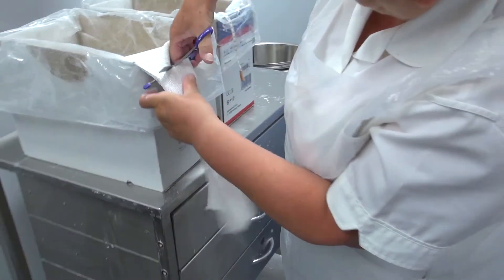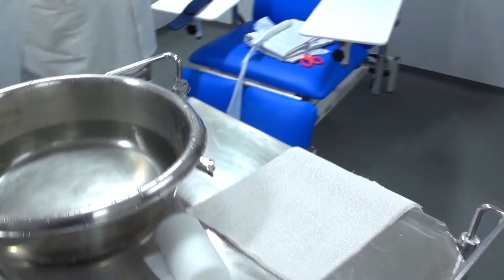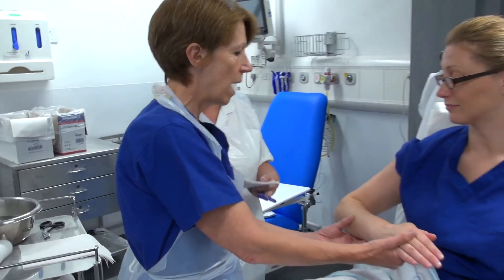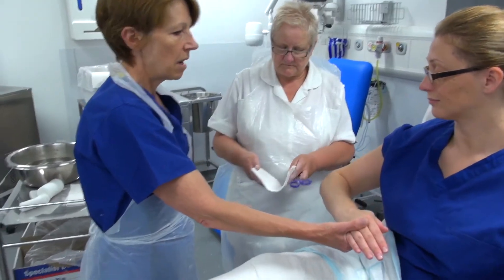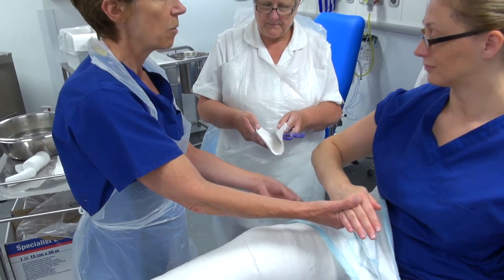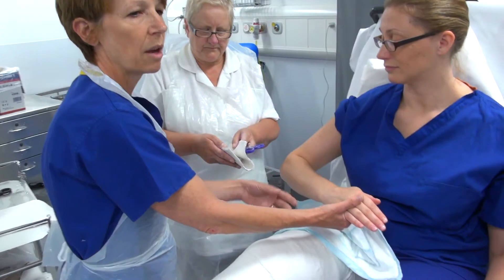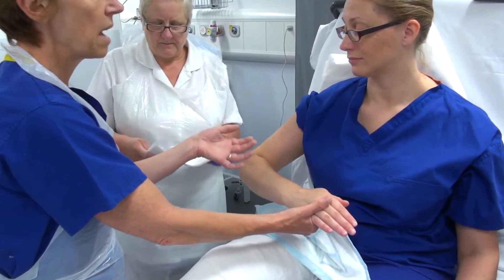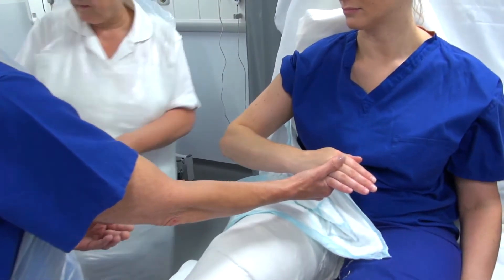Pam is just preparing the back slab, which is a 20 centimetre bandage and it is five layers thick. She's also taken a wedge of plaster which is going to be used as a slab on the bottom of the cast. This allows the weight to develop, which will allow the humerus to relax down, causing proper alignment of the bone and also disimpacting the fracture. It will be folded like that.